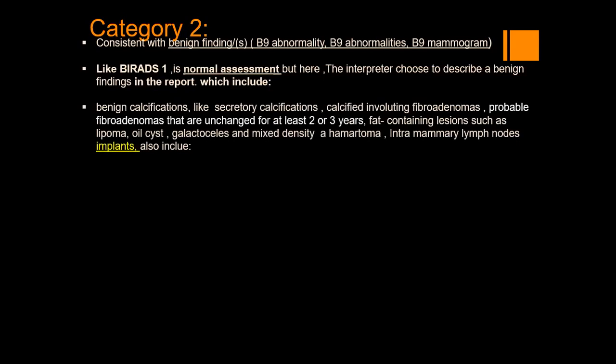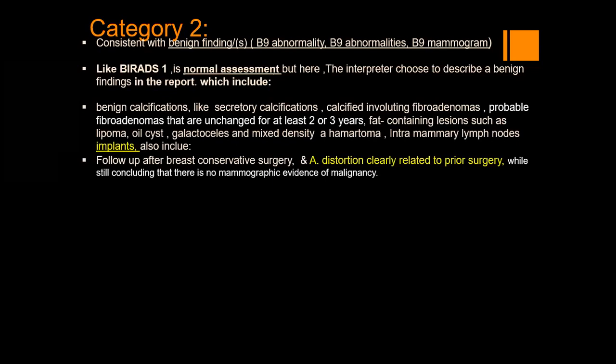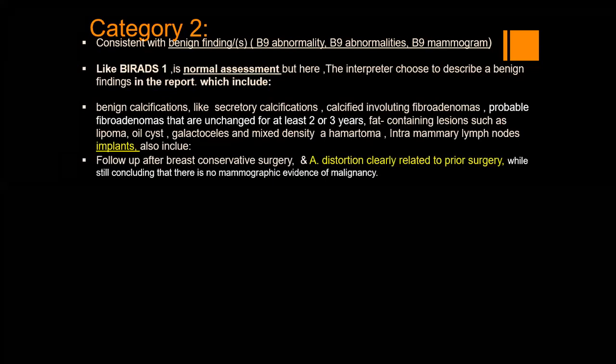Yes, benign calcifications, calcified fibroadenoma, probably fibroadenoma unchanged for at least 2 or 3 years, fat-containing lesions like lipoma, oil cyst, galactocele, mixed density like hamartoma, intramammary lymph node, implants, and also follow-up after conservative surgery, a distortion clearly related to prior surgery, while still concluding, to protect yourself, that there is no mammographic evidence of malignancy.